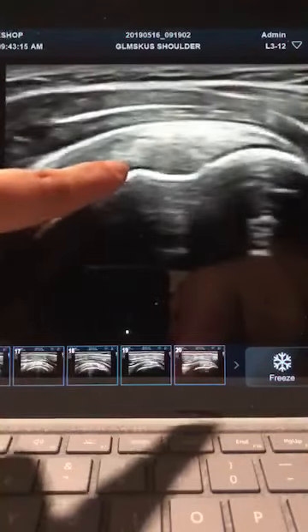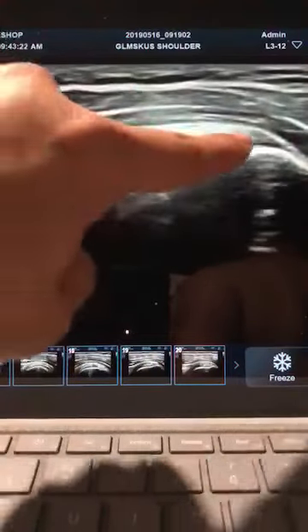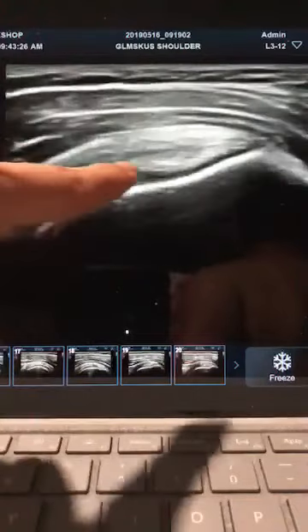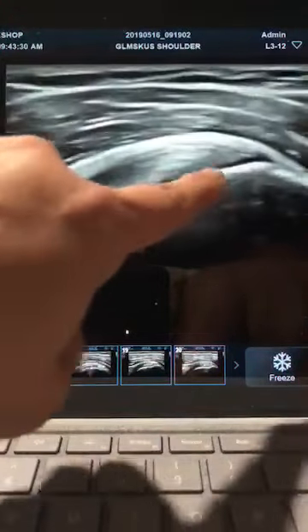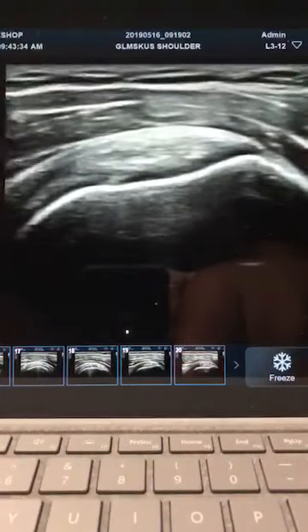Now we're definitely in the overlap. So the fibers that we see here now are infra. These are supra. A lot of people mistake this area for just supraspinatus, but the anatomical neck has flattened out. We are truly at the overlap. If I come out a little more lateral, then the anatomical neck is completely flat, and all of these fibers here are the infraspinatus fibers.